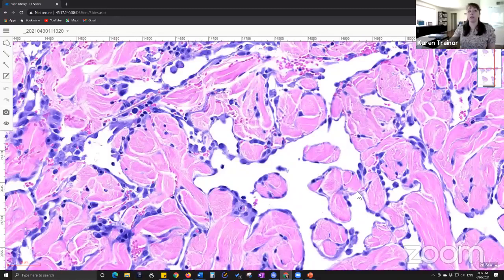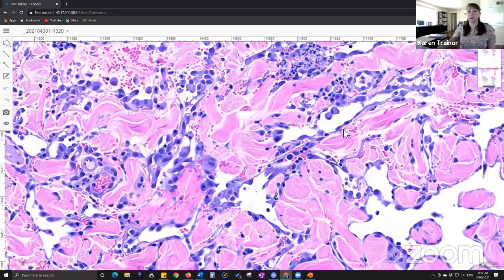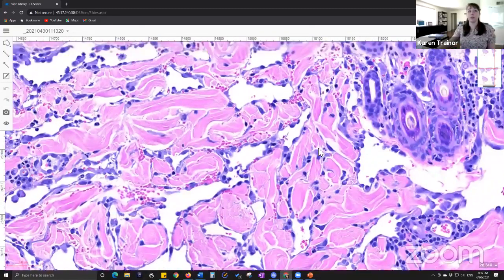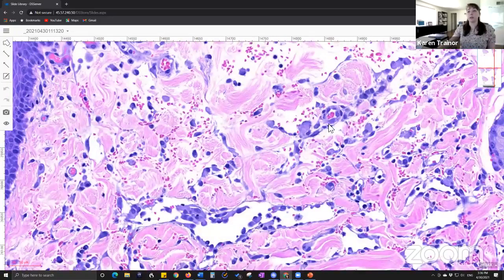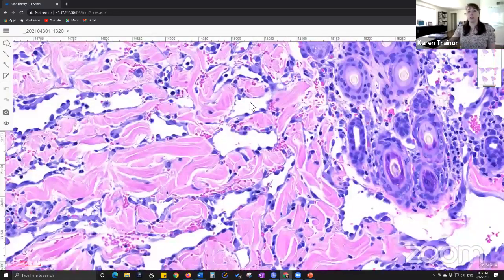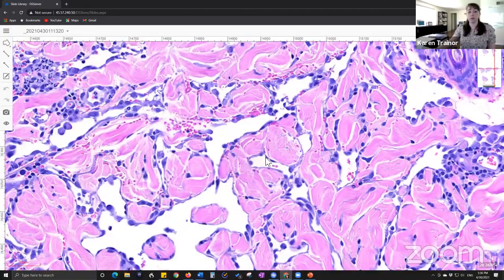That's what these are called. And if we look around, we see how plump these endothelial cells are. Sometimes they're described as turtles on the shore, which I think is a lovely description for them. They're just sort of resting, and you can see like a turtle shell just bulging into that lumen there. And then what's interesting to note is how sparse. So here's a blood vessel with erythrocytes in the lumen, and another, one more. Here we go. We're seeing them now. But what to make of all these clear spaces that have very sparse erythrocytes in those spaces?